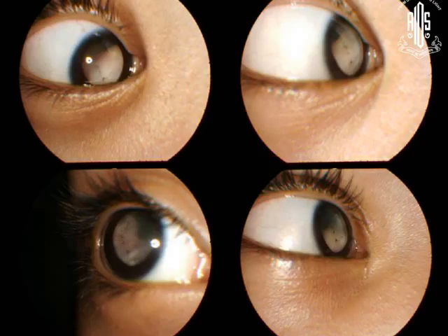This is a 6-year-old child presenting with a white reflex. So is it retinoblastoma? It is obviously not a cataract. The lesion is behind the lens, but something is different. It looks like a little bit of glial tissue also.